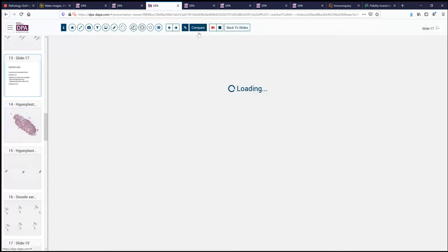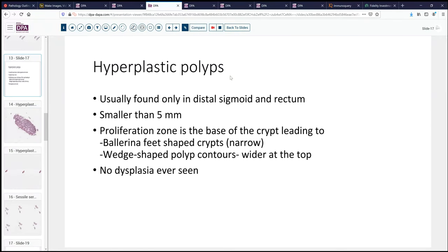In contrast to these are the hyperplastic polyps. These are usually only found in the distal sigmoid and rectum. They're most often smaller than five millimeters. In fact, I tell our surgeons that if they see a hyperplastic polyp reported in the right colon, they should be suspect they may be dealing with something else. In these cases, the lesions tend to be wedge-shaped — the surface contour is wider than the base. The small, narrow crypts at the base have been likened to ballerina feet with very pointed toes. And these are not associated with dysplasia; if there's dysplasia, it is not a hyperplastic polyp.